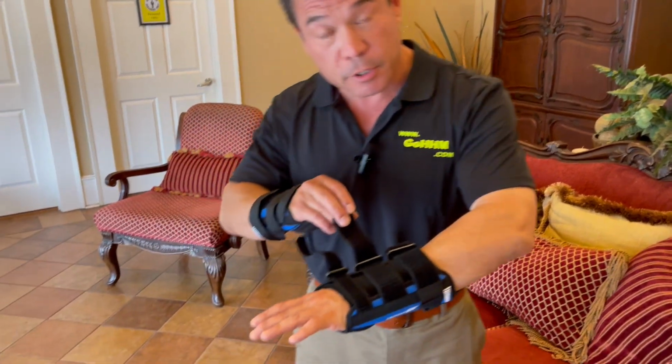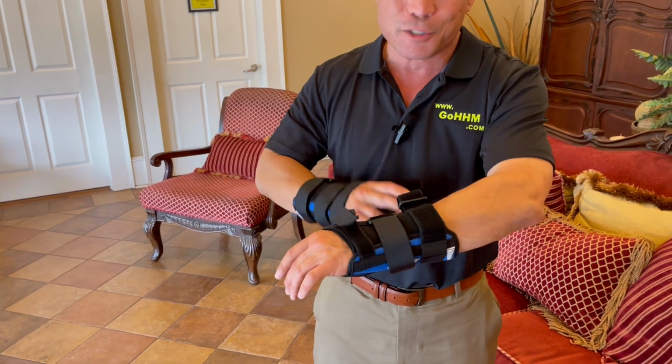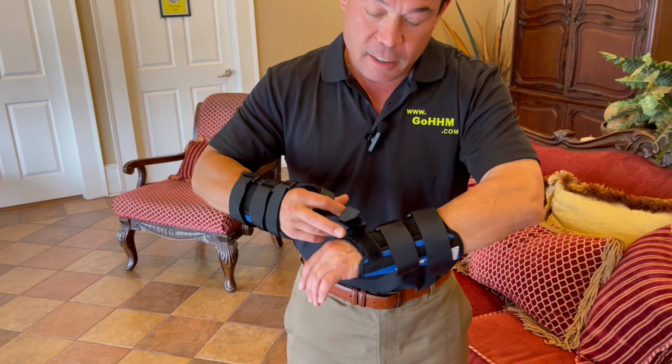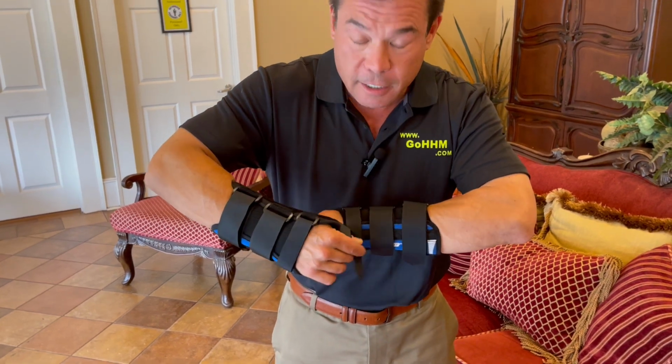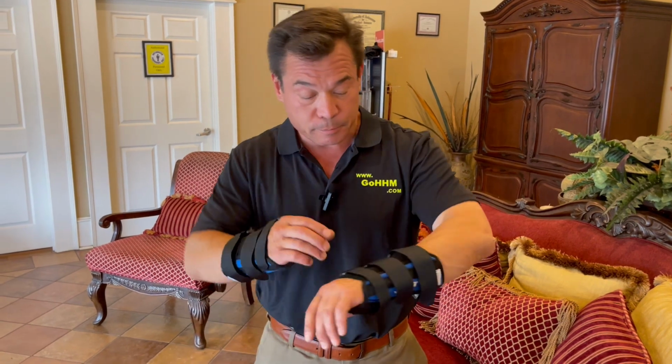Now when I have people put these on, generally I have them start with the middle portion of the brace, go to the back side, and then go to the front. Now you don't want this on there too tight, but you just want it tight enough that it keeps your hand nice and steady and immobile.